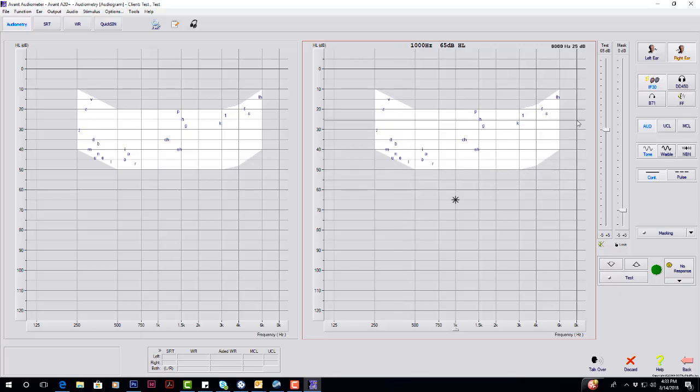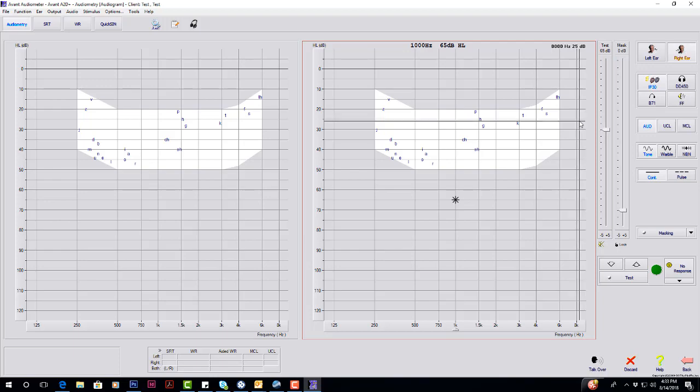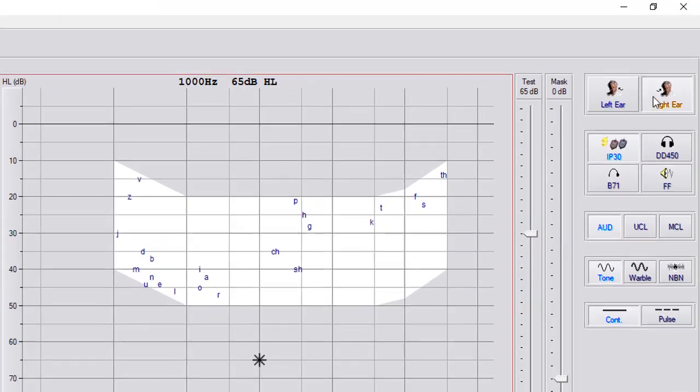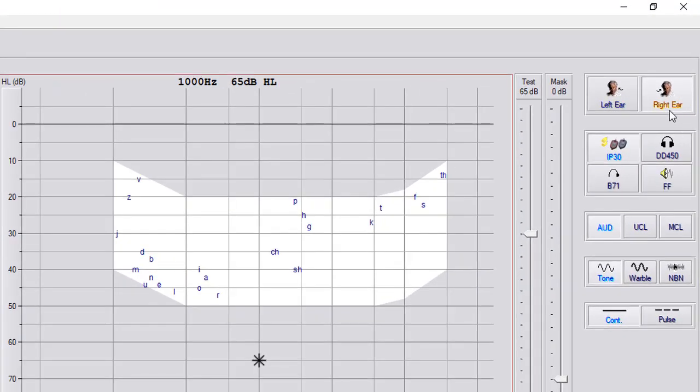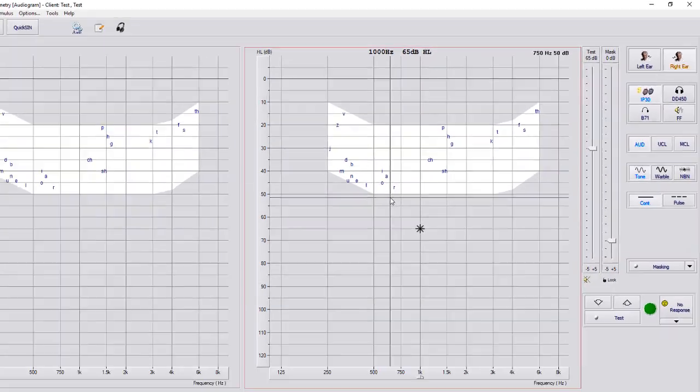Right now, we're going to go into our air conduction. We're on the right ear with the IP30s. AUD is going to be for your standard audiometry with a tone continuous.